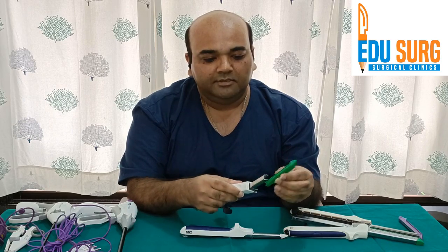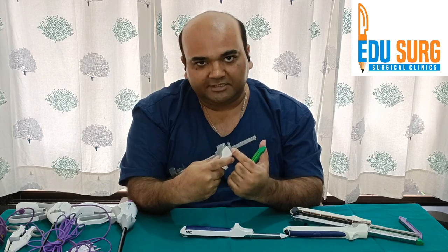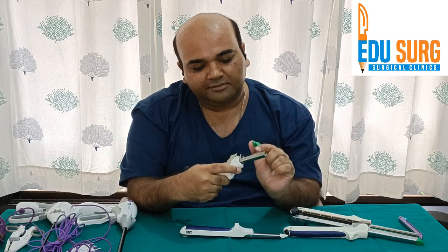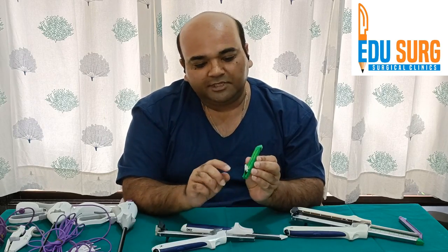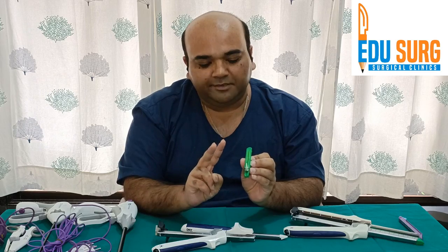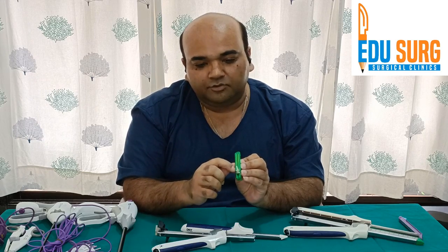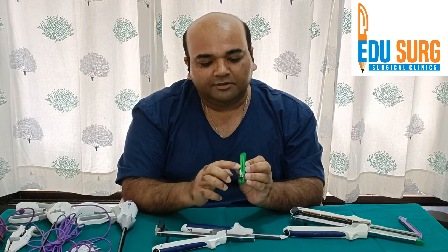This is a 60 mm cartridge. You can see markings up to 6, where 1 centimeter equals 1 mark. If you see the number of rows, there are 4 rows — this is known as 2-layered stapling. If there are 6 rows, it is 3-layered stapling.